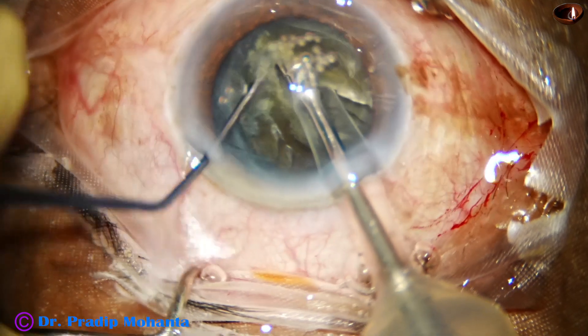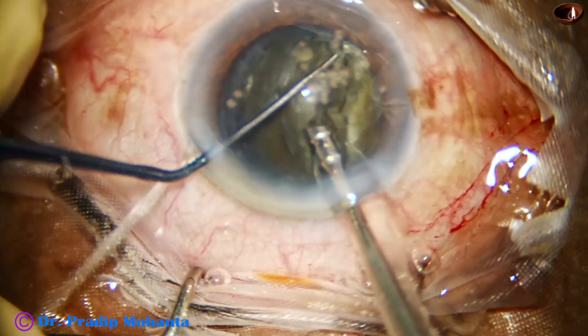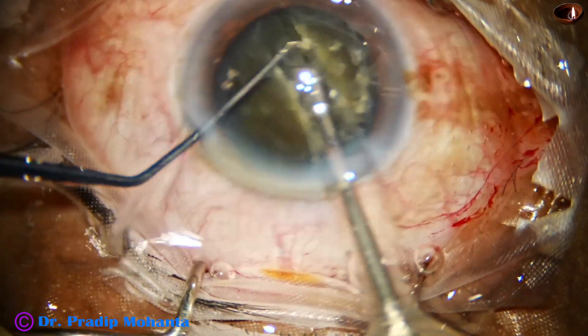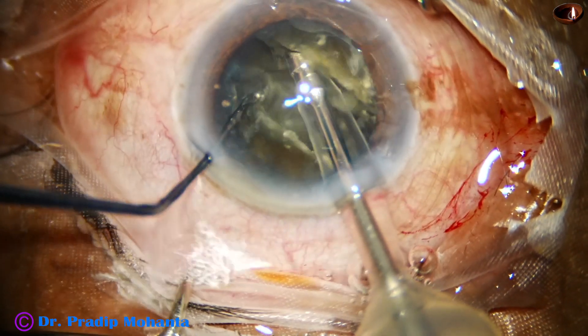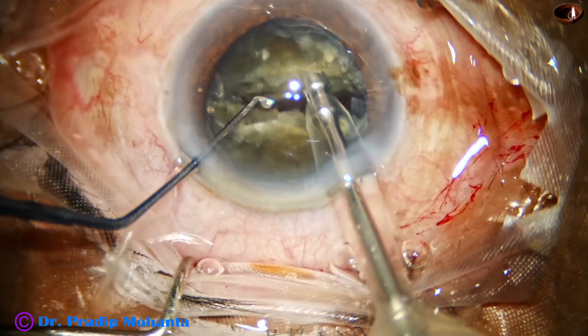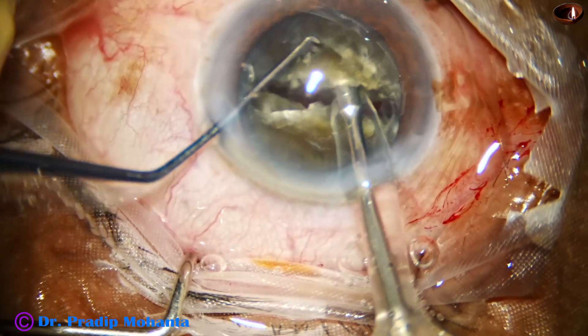Whenever these air bubbles are there, we have to use irrigation and aspiration — we have to come to position 2 of the foot pedal, remove the air bubbles as much as possible, and then continue. In this case, I did that, and then I continued.